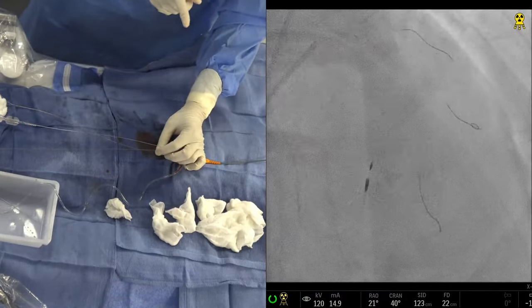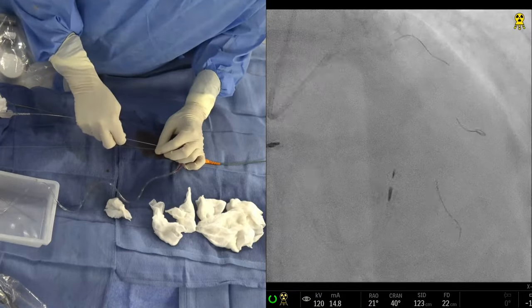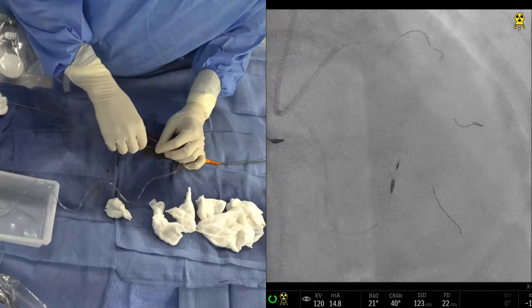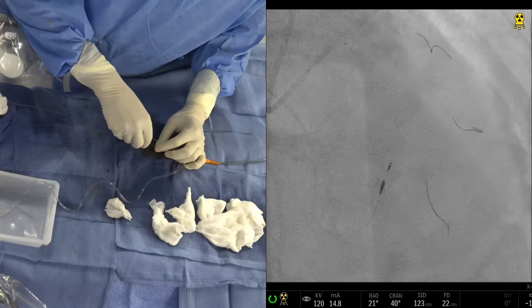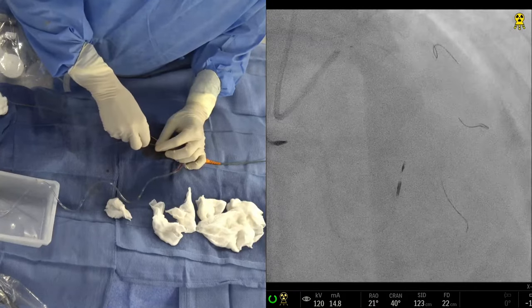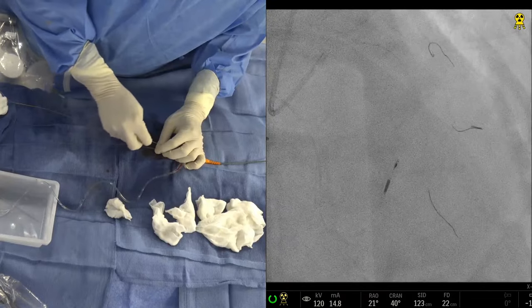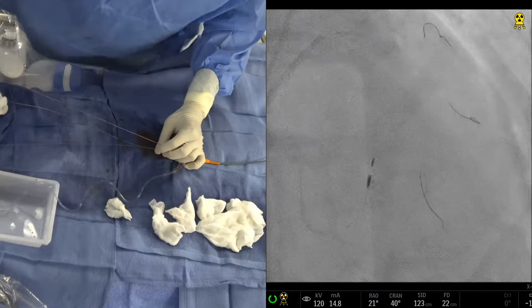Now you see how much I'm struggling already? Just with the cutting balloon. No, the cutting balloon will not go. Go with the high pressure. You have the 2.5 balloon. No, that's too long. I'm just telling you, we should have bought this right now. If something happens to the D1, then we are all stuck. There's no way. Forget anything, get a regular balloon. Okay, let's cut here and then see if it makes the room.